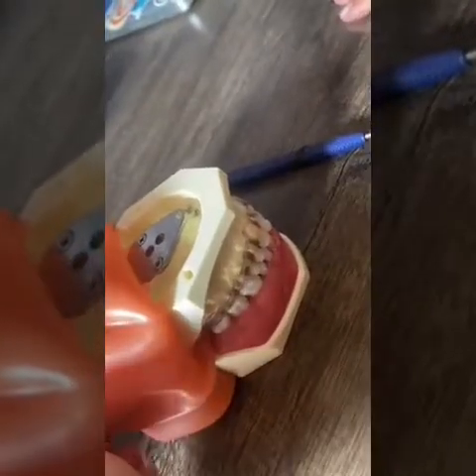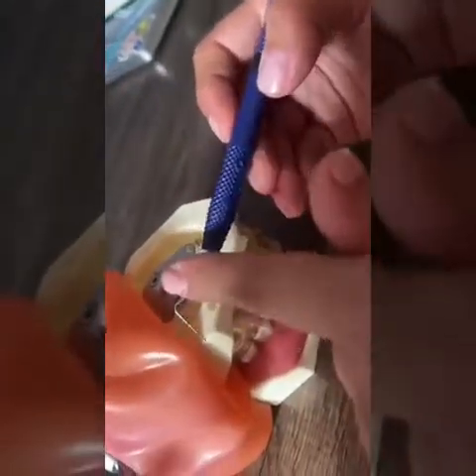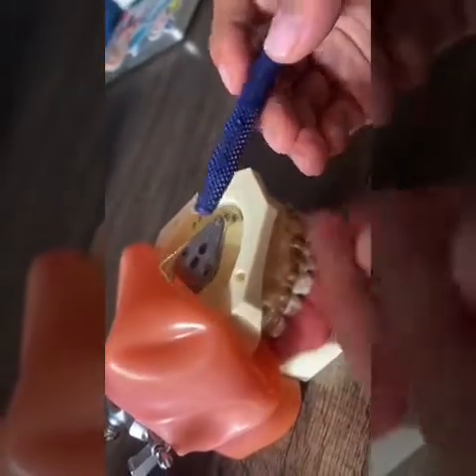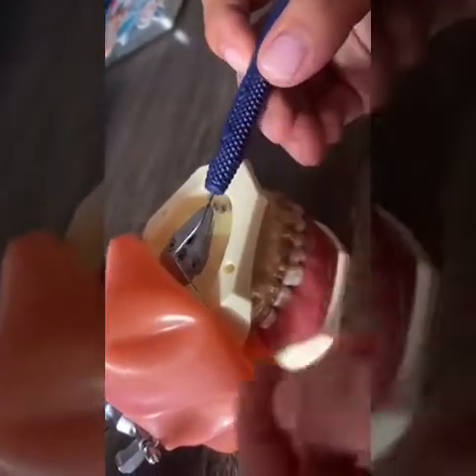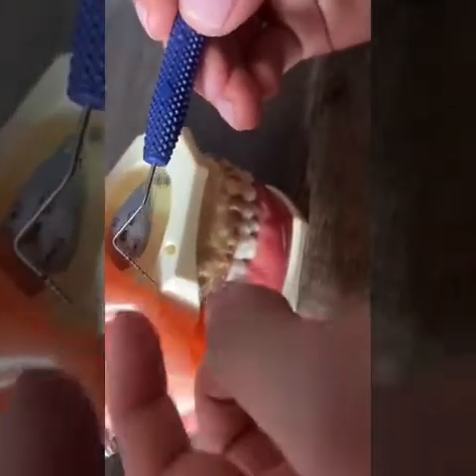Hello everyone, my name is Nicole Ramirez and today I will explain and demonstrate the proper use of the UNC 12 probing instrument. This probe has a handle, a shank, and a thin working end. It's used to record depths up to 12 millimeters and has markings at each millimeter. The black colored bands are at 4 and 5 millimeters and 9 and 10.